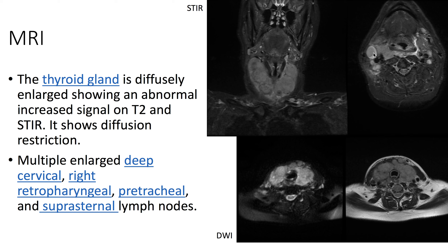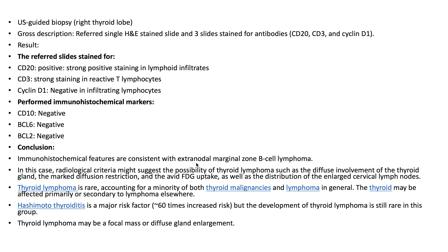The patient underwent biopsy, which revealed a diagnosis of extranodal marginal zone B-cell lymphoma. In this case, radiological criteria might suggest the possibility of a thyroid lymphoma, such as the diffuse involvement of the thyroid gland, the marked diffusion restriction, the avid FDG uptake, as well as the distribution of the enlarged cervical lymph nodes.